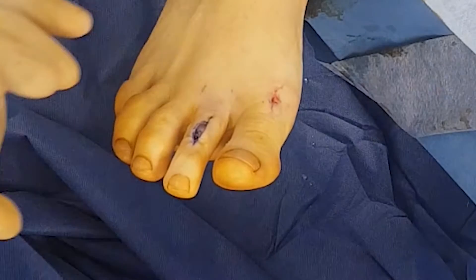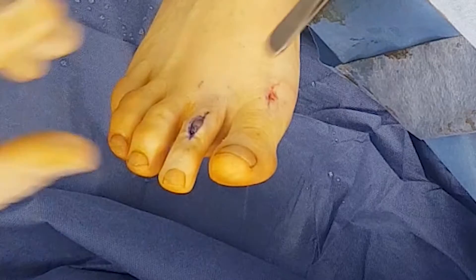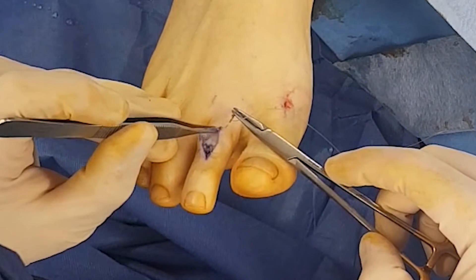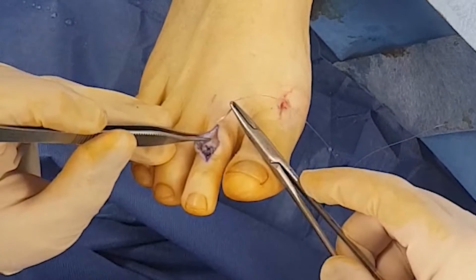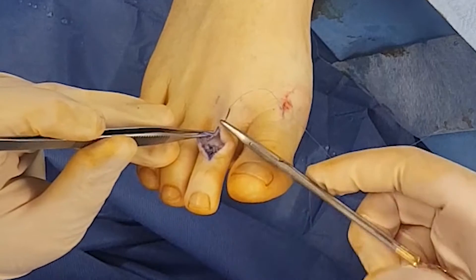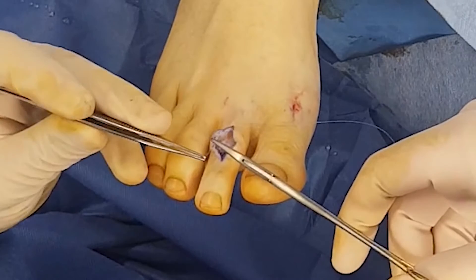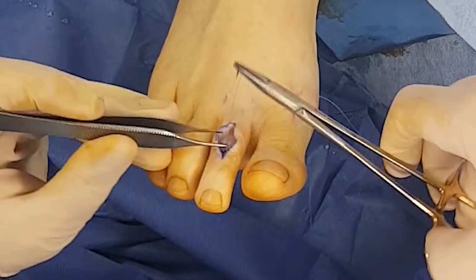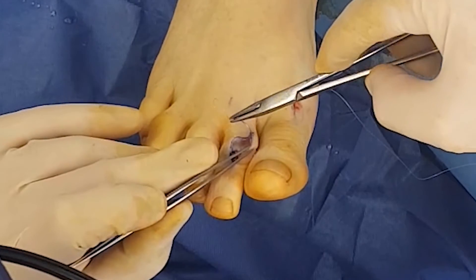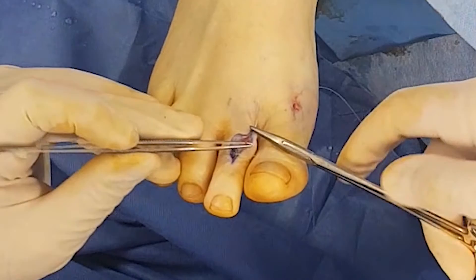Now that the tendon was repaired — we used 2-0 vicryl suture to do that — we're going to start with the skin, and we're using 3-0 monocryl here, which is also an absorbable suture. The technique is a running subcuticular method, and cosmetically they end up looking pretty good with just a fine white line once the scar has completely healed. I don't tie knots at the end; I just hold the ends with the steri-strips.